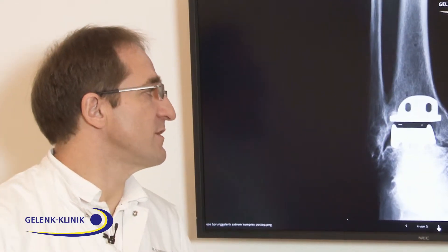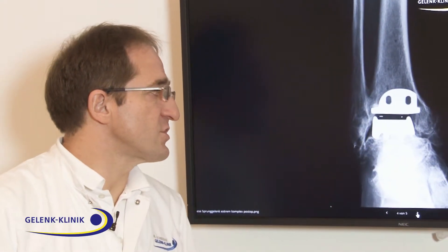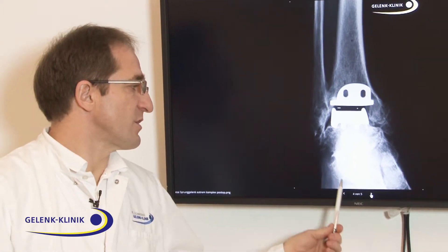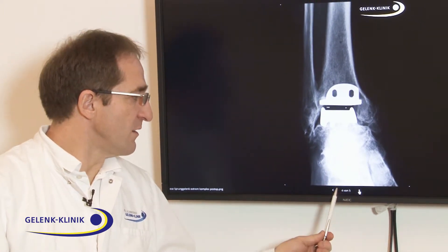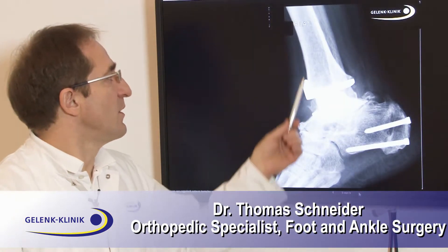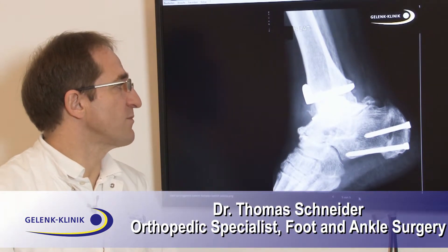If you look on this X-ray, you see the good position of the ankle replacement. And you see there is an additional treatment of the heel — the heel with the Achilles tendon brought into a better position so the ankle replacement can stand.